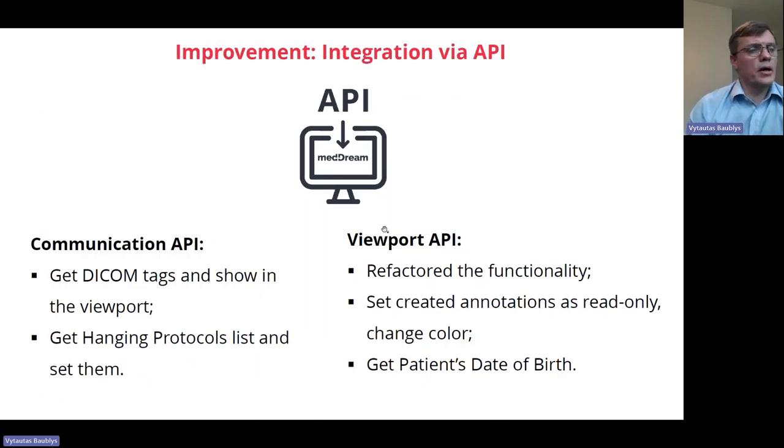And we again improved the integration functionality. The API contains several more functions which can be accessed through API calls, and please check the documentation for more details on how to use these new API improvements and how to access them.